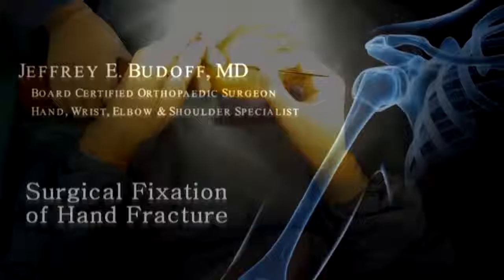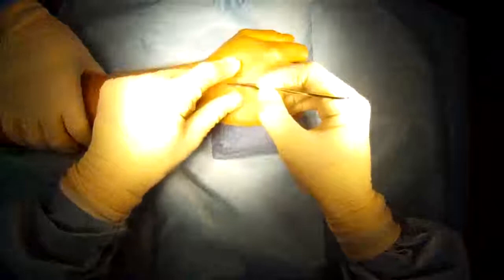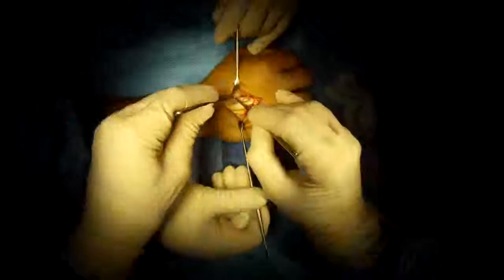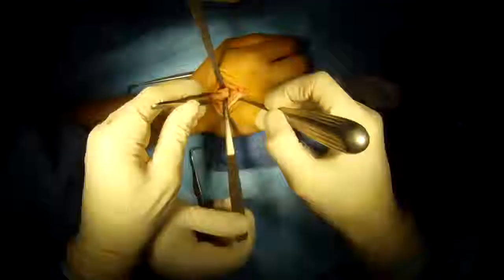Surgical fixation of a hand fracture. This patient broke a metacarpal bone. This is the place that needs to be fixed. We're going to dissect down through the tendons and expose the bone.